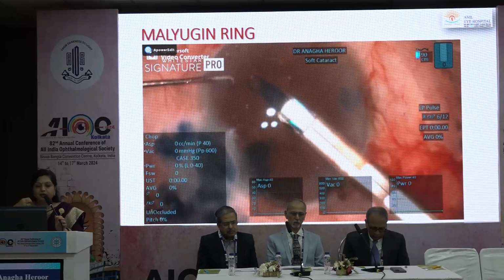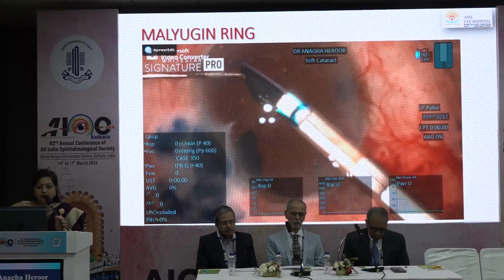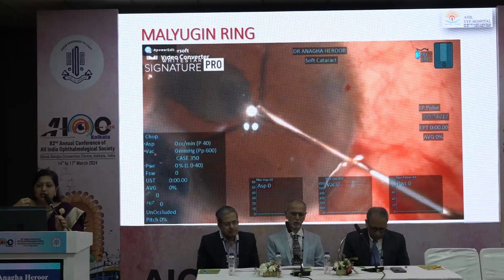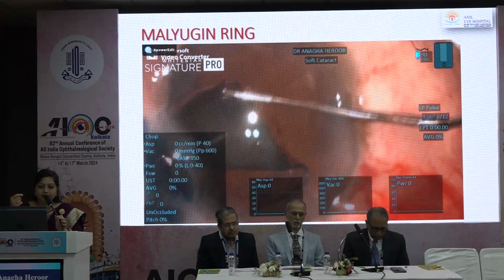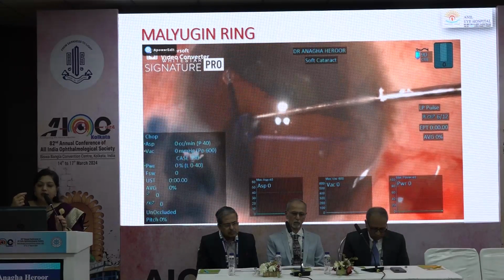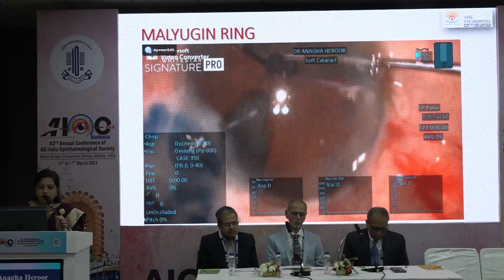It's a preloaded one, so you just put it into the injector, and then very gently each of the scrolls, you can use a Sinskey hook or the Y hook like this. Each of the scrolls is then straddled onto the pupillary margin.